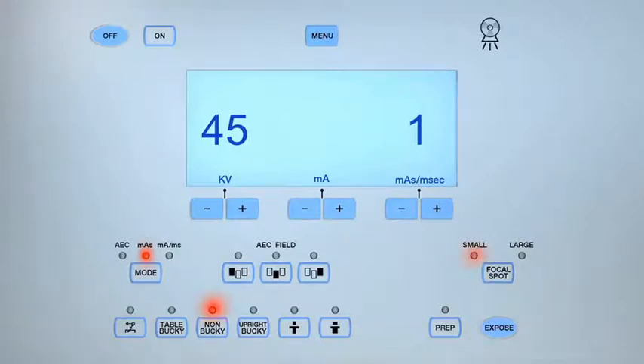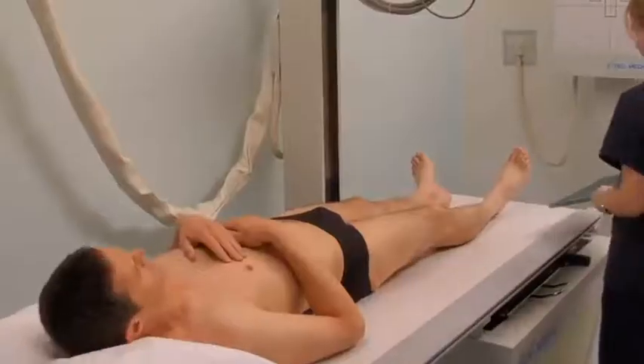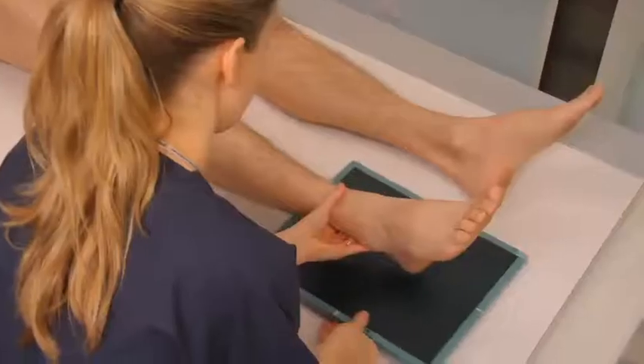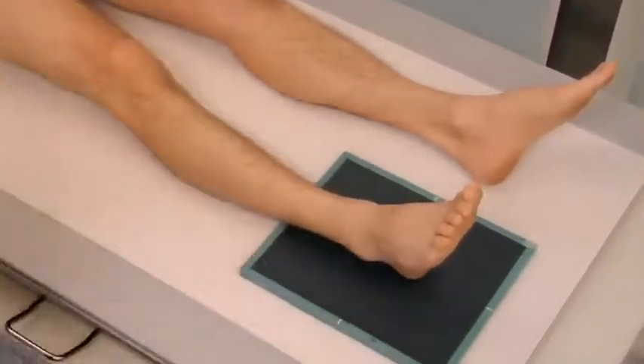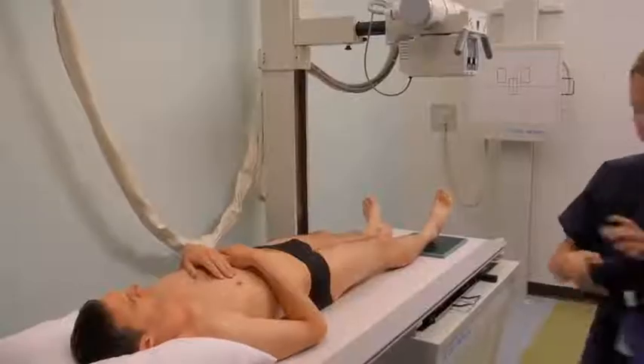For an AP axial toe, select the non-bucky and small focal spot setting. Set the exposure parameters to between 50 and 55 kilovolts (KV) and 2 to 3 milliamp per seconds (MAS). Ask the patient to lie supine on the radiographic table and place the cassette under the foot. Set the source to image receptor distance (SID) to 40 inches. An SID of 40 inches is the same for all lower limb projections unless stated otherwise.